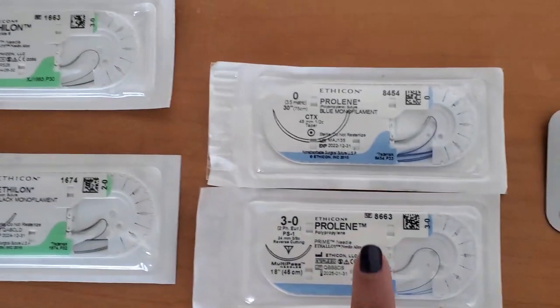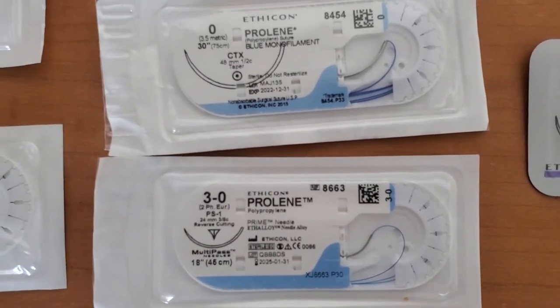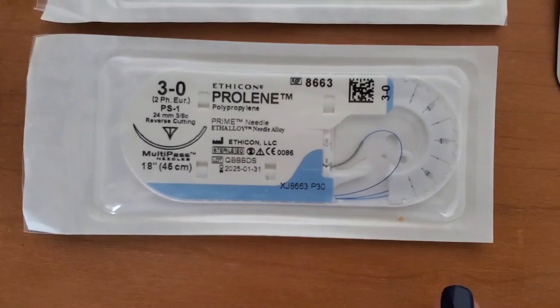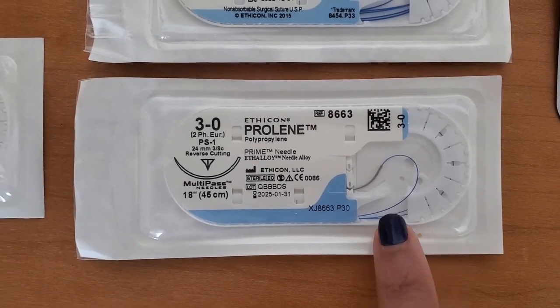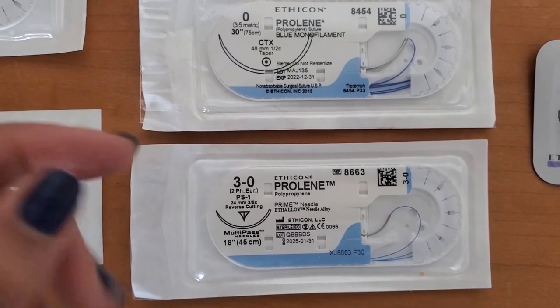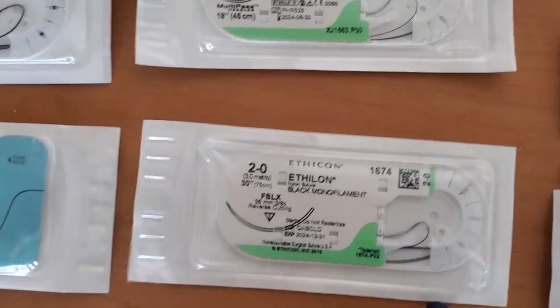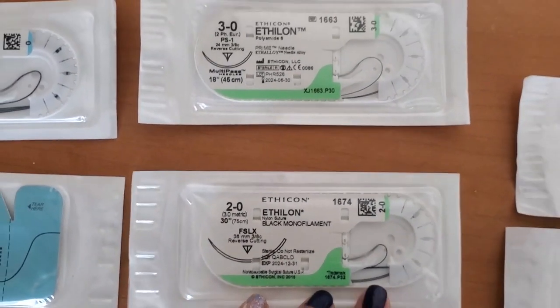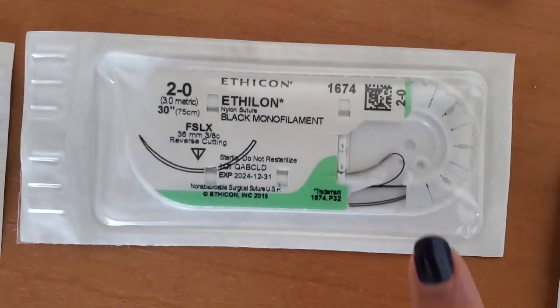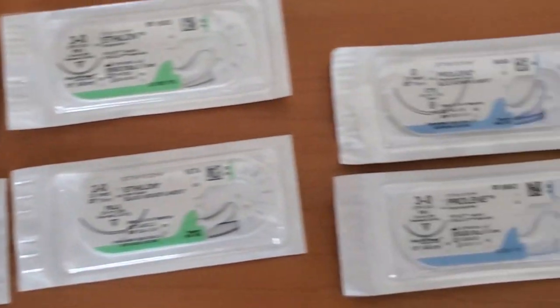You can really see it a lot better with this 0 Prolene and 3-0 Prolene. You can tell right here that the 0 Prolene needle is way larger than the 3-0. And if you look closely, you can see that the filament is actually smaller. It's kind of like a nylon thread, and it's a lot smaller. So again, here with the 3-0 and the 2-0, the larger the number, the smaller the filament. You can see the 3-0 is a lot thinner than the 2-0. And all of these sutures here are non-absorbable sutures.